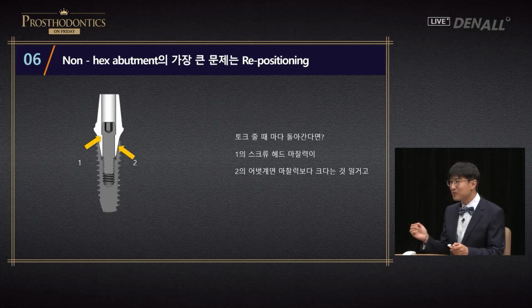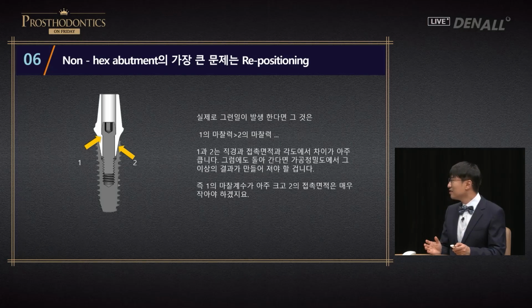You can answer now. The friction of screw and screw head and the surface. There is a stark difference in terms of friction. If it rotates, if torque is given, friction of number 1 needs to be bigger than number 2.